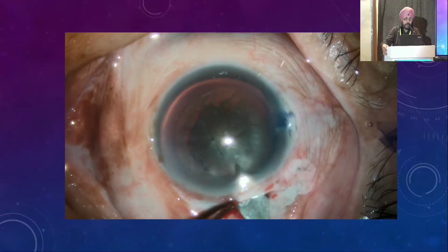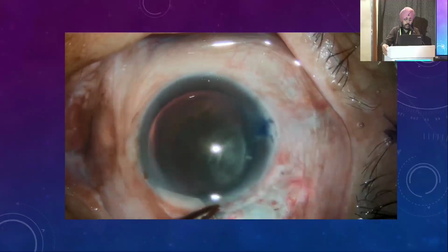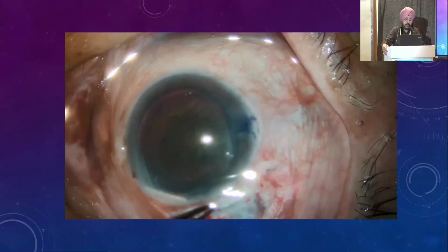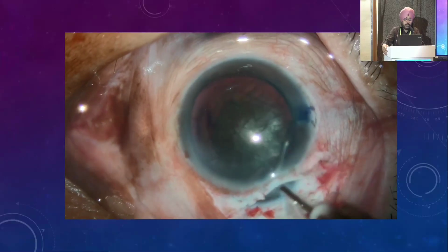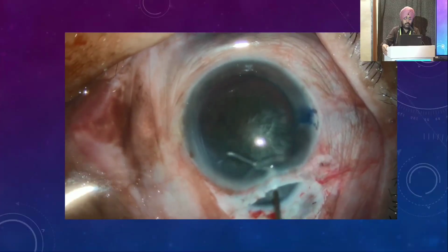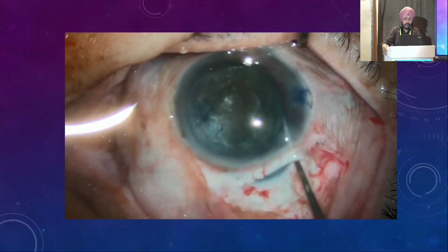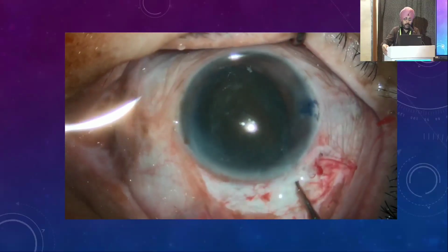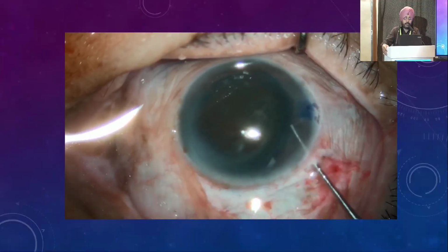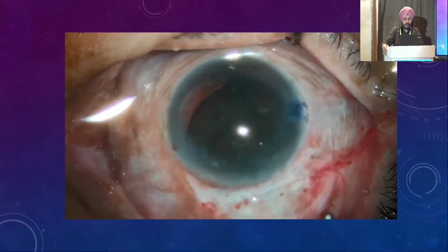And the inner incision, as our previous speaker highlighted, should be approximately 1 to 1.5 mm more than the outer incision for easy expression of the nucleus from the anterior chamber to the outside, with good hydrodissection. After that, good rotation of the nucleus. While rotating, it is very easy from the bigger capsular access to expulse the nucleus into the anterior chamber. So you can see the size of the nucleus. It is very big.